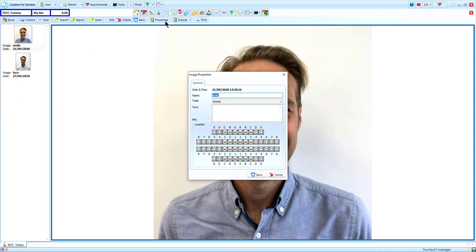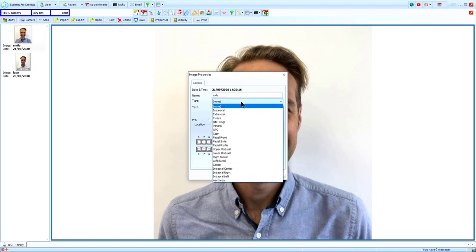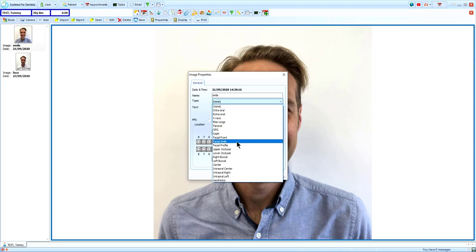Properties tags the image with important information. The name is taken from the name of the original image file. This can be changed here. In Type, you can select the image type. For example, I will select Facial Smile.